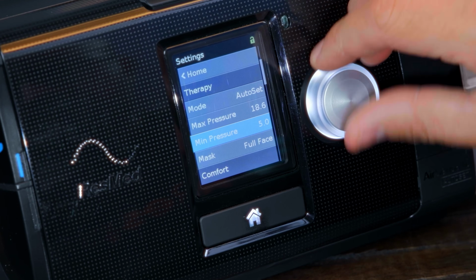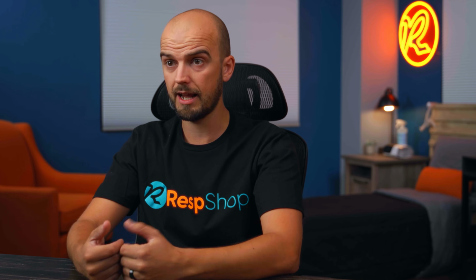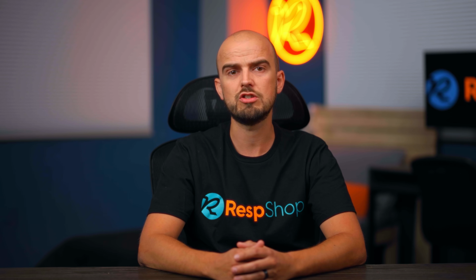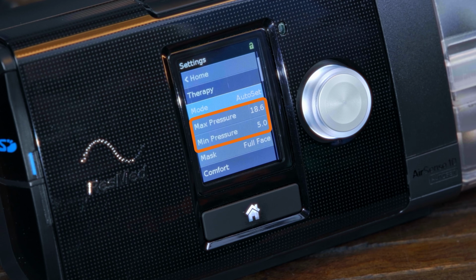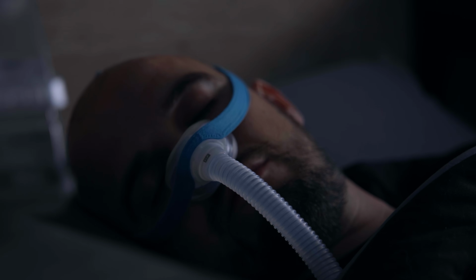If they're too high, the extra pressure might overwhelm your lungs' capacity to intake the air, and the excess air forces itself into your stomach instead. But if it's too low, you may have more gasping apnea events, which means you suck air into your stomach that way. The solution here is to get your therapy pressure settings just right. This should be done in consultation with a physician, but a general principle is to keep your apnea events under control at the lowest pressure possible.